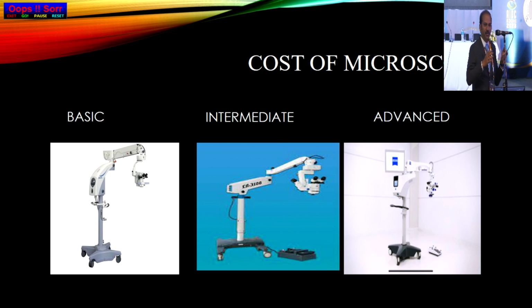Even if you want to go for a premium cataract practice, your surgical steps have to be refined every day. For that you need a recording system. So check the compatibility of the recording system with your microscope. That is also very important. So continuous zoom, yes, if that is an option and inside your budget, definitely go for it.